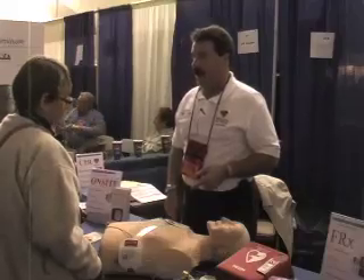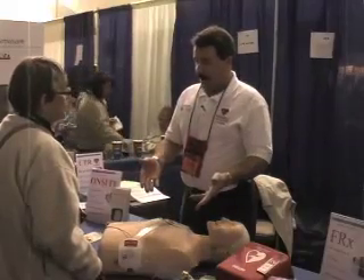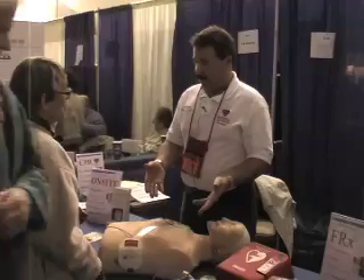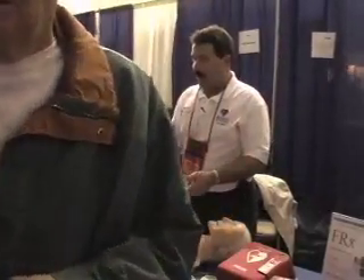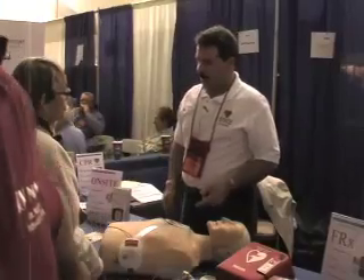You push the blue button and it'll say: tilt head, pinch nose, give two slow breaths — breathe, breathe. And then it'll tell you to go to the chest and begin your compressions.